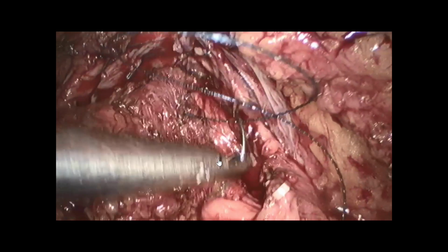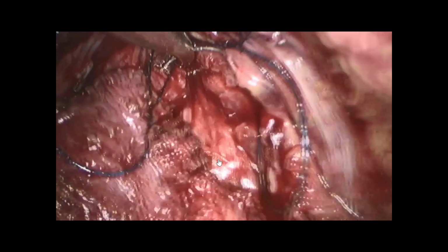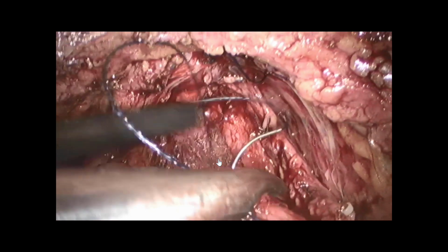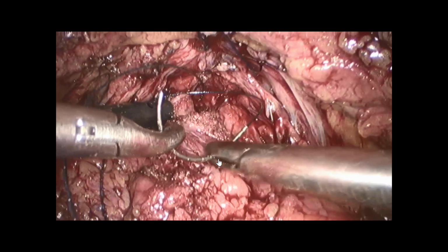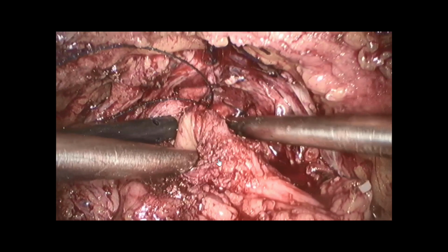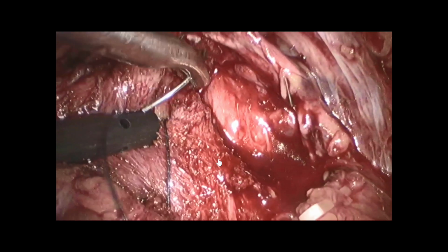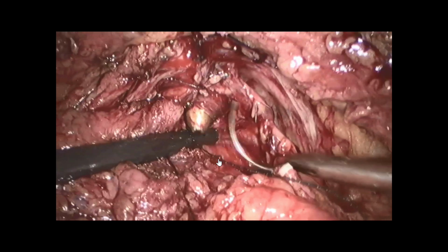And you see, it's like a ballet. I know exactly which hand will do which number. So it's like a clock, 7 o'clock, 5 o'clock, 3 o'clock, and it's right hand, left hand, forehand, backhand. There is no question. And my residents, when I let them do it, I say, okay, this point, how will you do it? They must know perfectly how it is. And you see, it takes really a few minutes, because it's always the same. You have seen this morning, it was exactly the same. Here it's easier because it's my needle holder, but it's exactly the same.